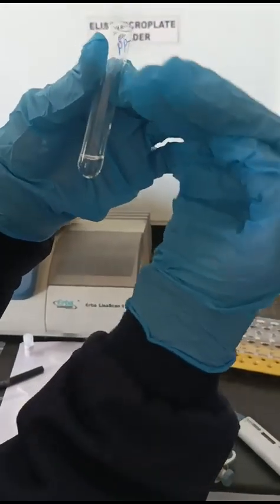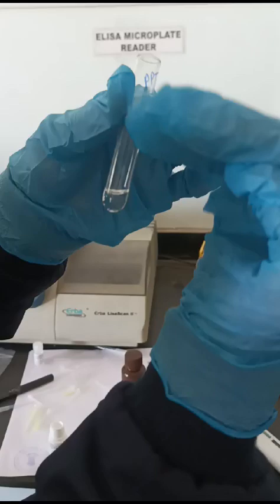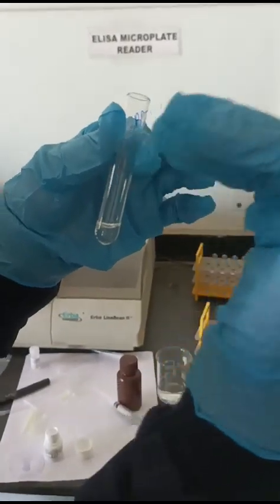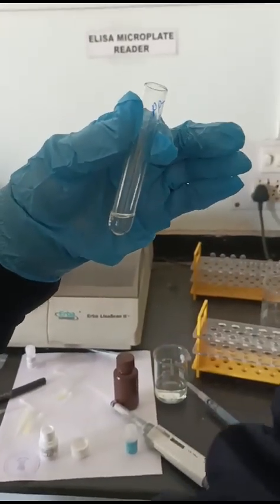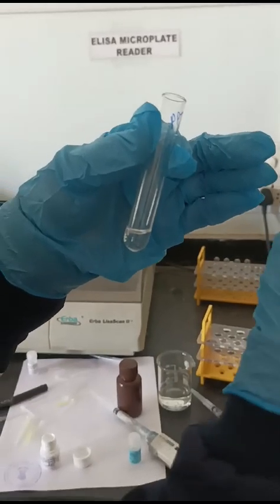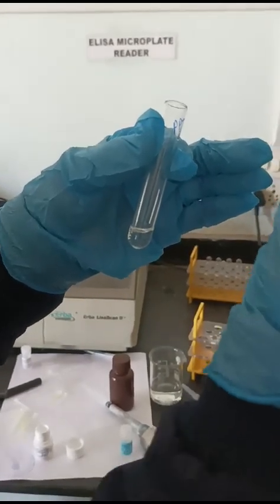We will be using the supernatant part which contains only the HDL. That will be used as a sample to proceed with the test using the instrument. Follow the steps, press test number 21, then blank, standard, sample. It will be the same thing.